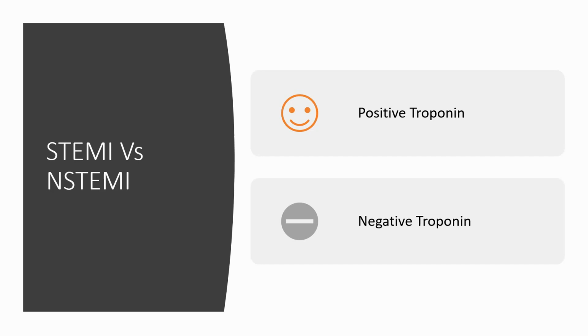So the interesting thing about NSTEMI is that a lot of times when these patients are cathed the next day, they usually try to take them to the cath lab within 24 hours if they don't have EKG changes but the troponin's positive. But about 25% of those patients who are deemed an NSTEMI have a coronary occlusion the next day when they perform the cath. So it's quite possible that these patients did have some EKG changes that just weren't appreciated by whoever was interpreting the EKG.